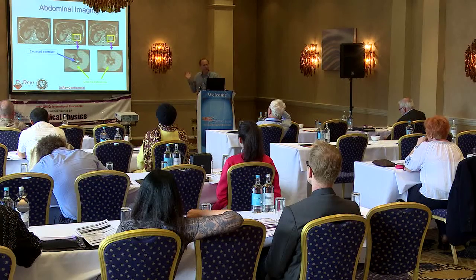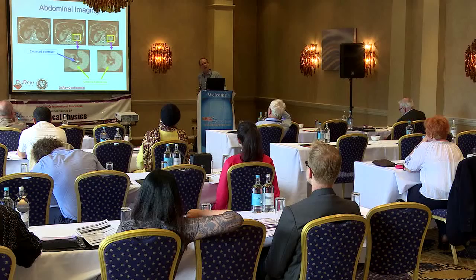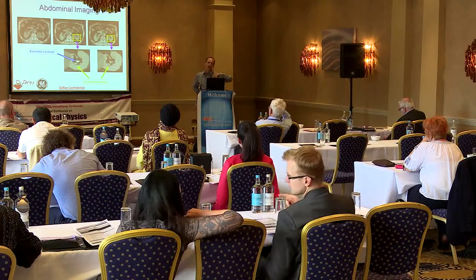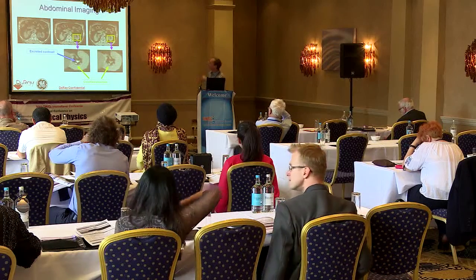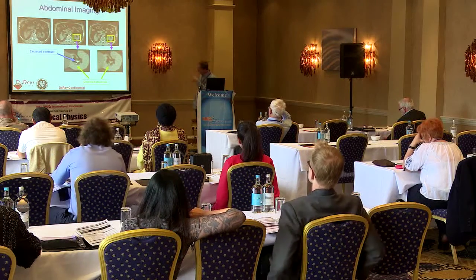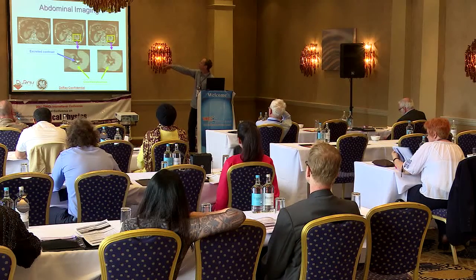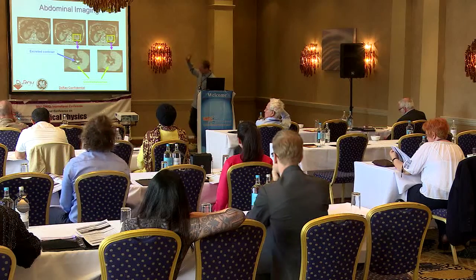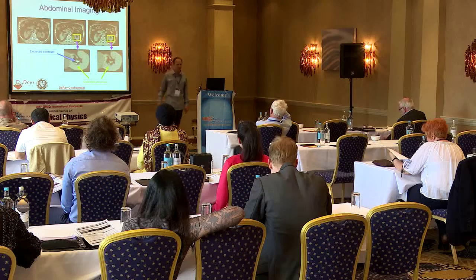And here are the results of an abdominal study. In this case, you would have maybe 3 scans: a non-contrast scan, then a contrast scan, and then wait a certain amount of time and do a washout study. But in this case, again, those 3 scans can be replaced with just 1 scan, since we can identify the excreted contrast, subtract it from the image, and see that this calcified structure is probably not going to need to be treated.